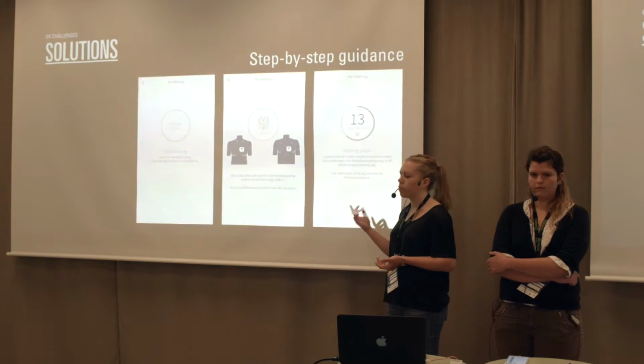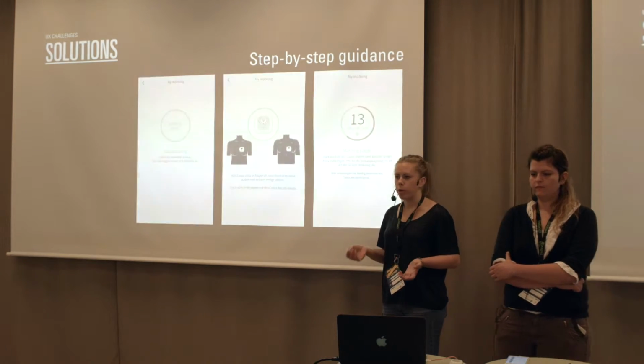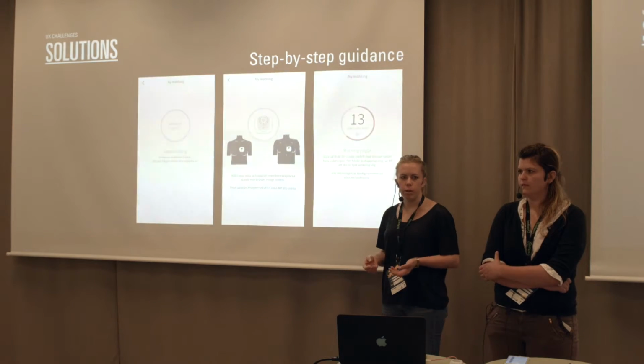And in here we also have to consider a lot of situations with the hardware. What happens if the battery runs out when you're doing a measurement, and what happens if the Wi-Fi goes off?